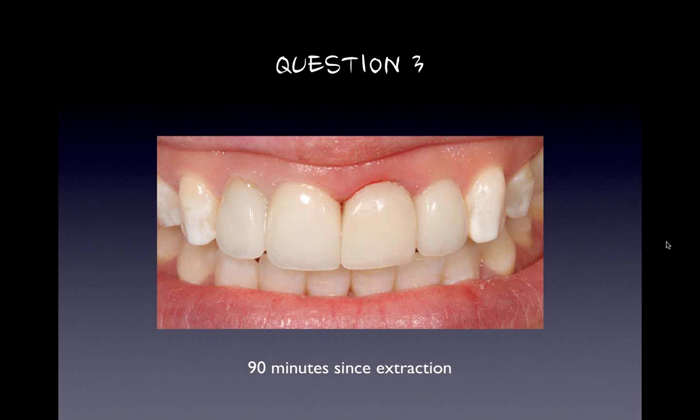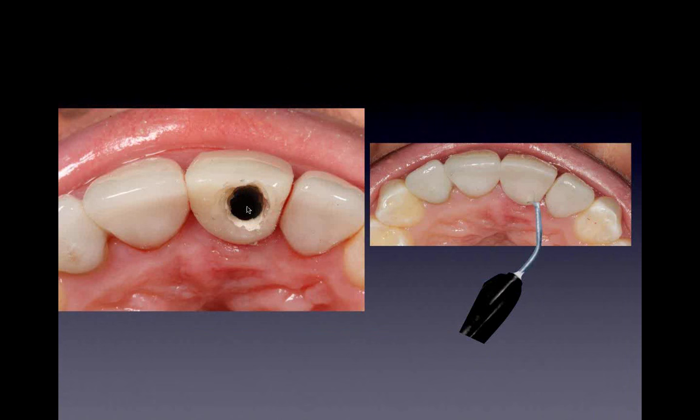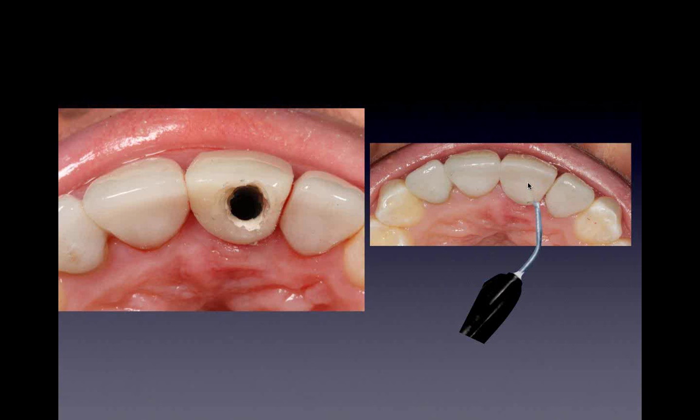OM implant, I don't know what that means. How do you remove the temp later from that implant? It's screw retained. So I'm going to go back a second just to show you. It's screw retained. There's Teflon in here. We're putting Teflon, which you can get at the drugstore. It's a thin Teflon matrix that you can put down there. And then we close it up with the flowable, as you can see here. And then you're basically drilling this out, getting back to this access hole. That's why I suggest always taking the photographs and making sure you get back to your access hole.